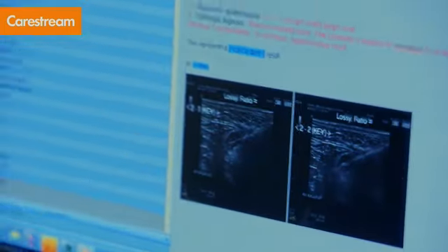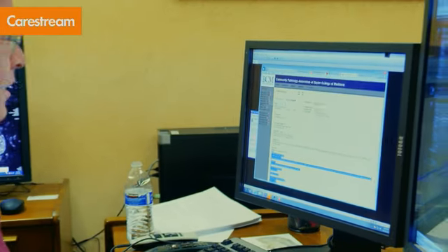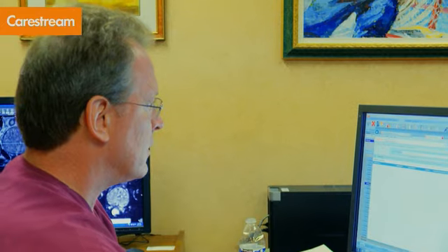At this point, we're logging into one application, Carestream. All of the centers are sending images. They're doing order entry, and once the QC is done and my staff have moved it into a dictation status, we're basically logging in once and seeing our worklist. We're able to use workflows to assign certain studies to radiologists so that they'll open up automatically in our queue.